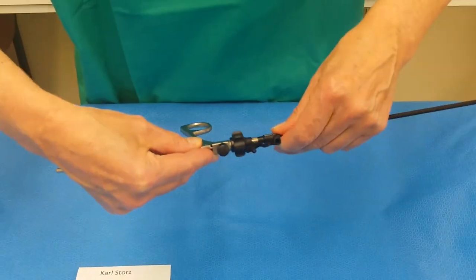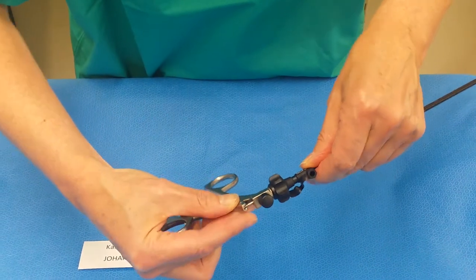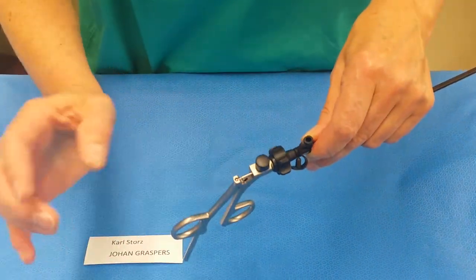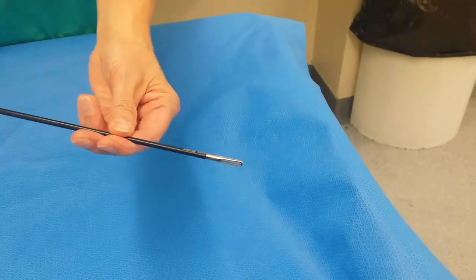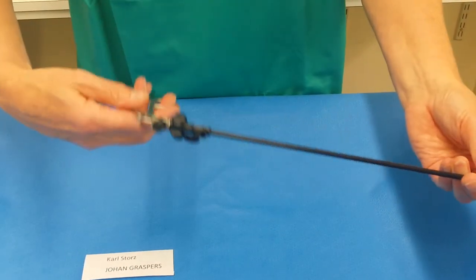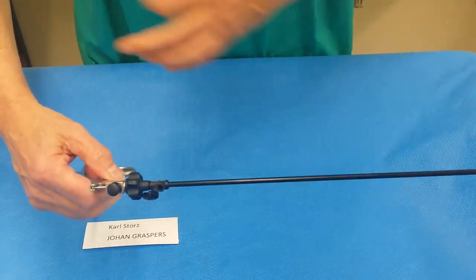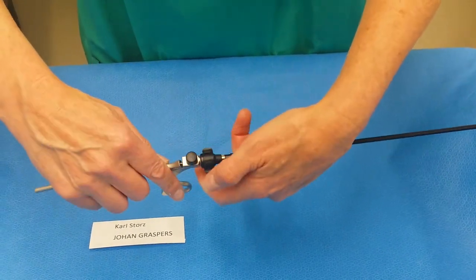You push the insert through and you can see the ball end on the insert goes into the little groove here and locks it. And that's all you do, and you test that it works. And Bob's your uncle.